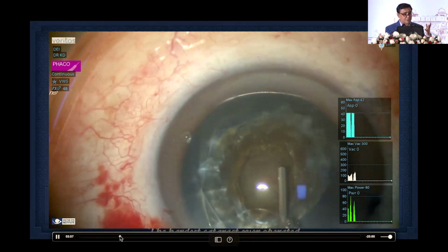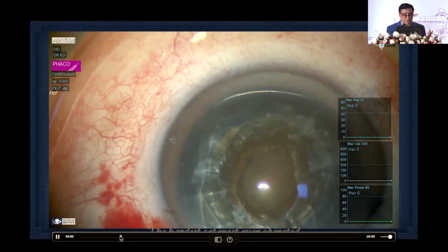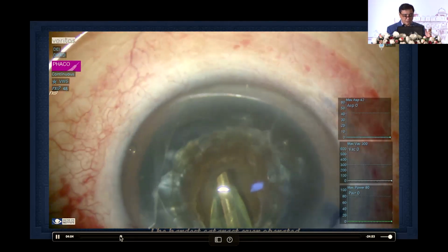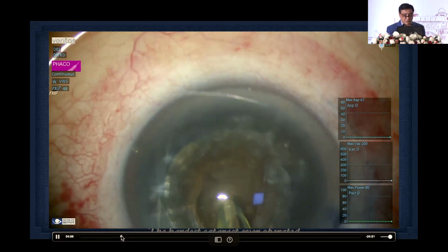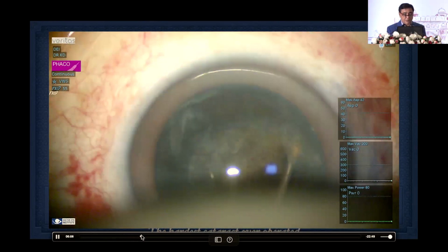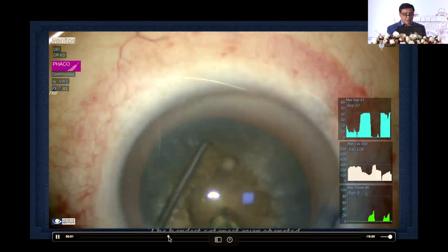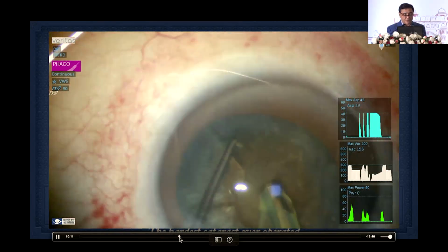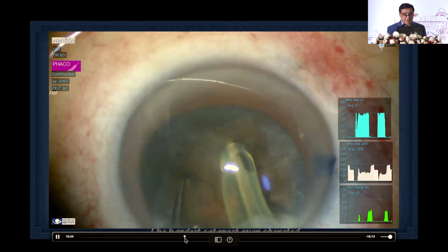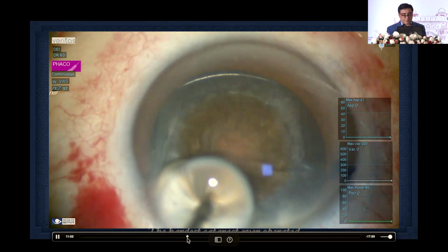And again, use more viscoelastic. So you can see I'm stopping, putting viscoat, stopping, putting viscoat. I'm specifically using the word viscoat because there'll be questions at the end of the procedure too. So I'm going around, and then bringing it, and then chopping, going around, chopping. I use a sharp tip chopper, no financial interest again. Different lengths of sharp tip chopper are available in the market. Normally it's 1.25, 1.5, 1.75.